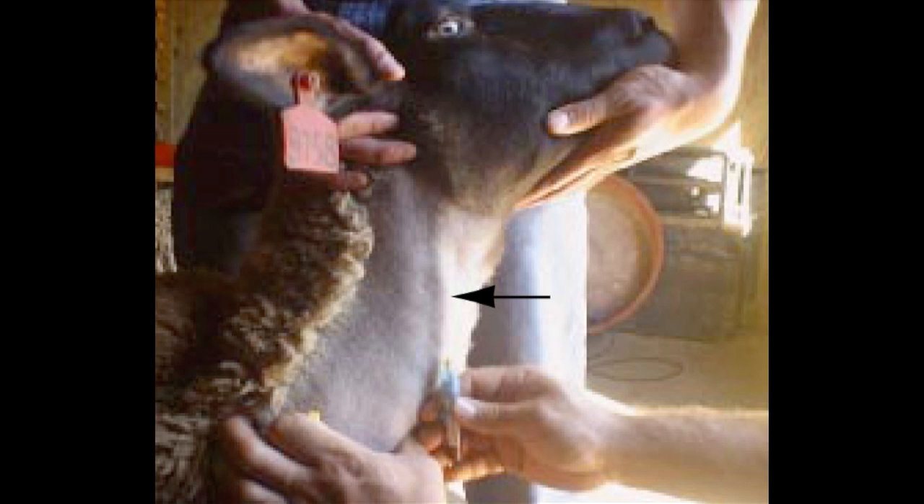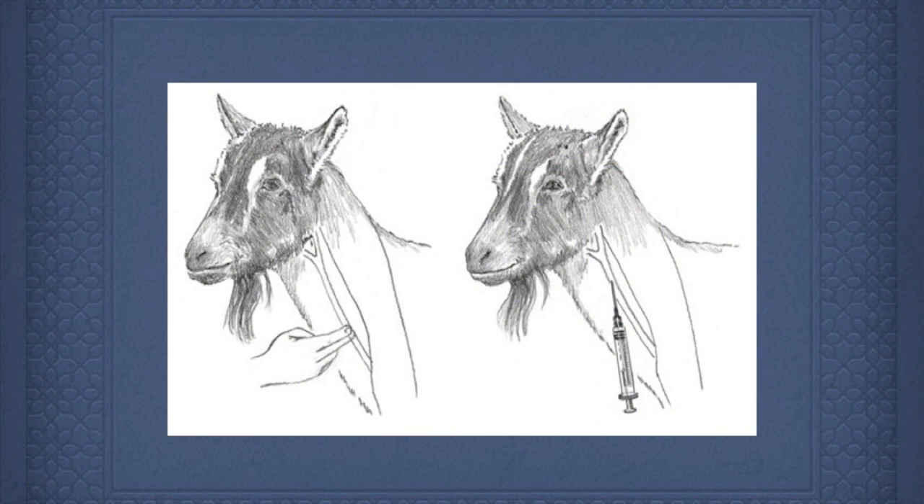To locate the vein, draw an imaginary line down the middle of the eye down the side of the neck. Apply firm pressure with the thumb and fingers in the jugular groove shown in this picture. The pressure will cause the vein to pop up and be easy to see.